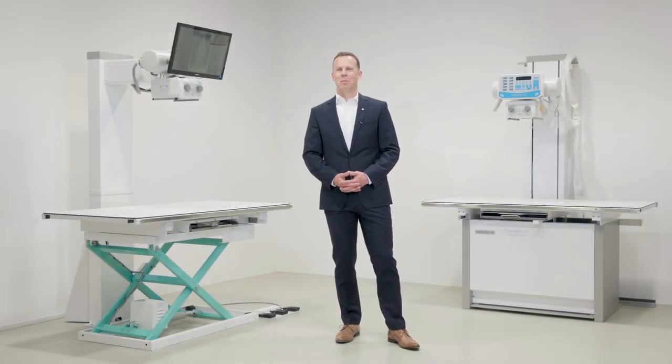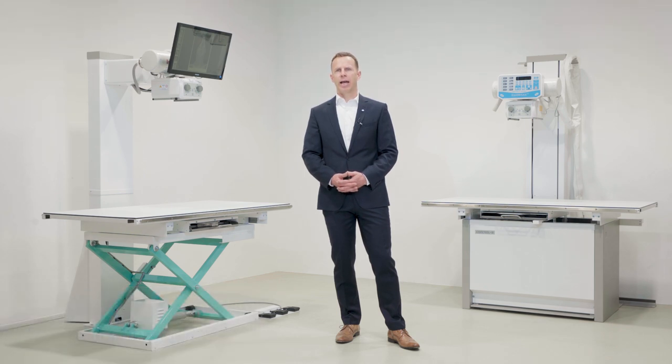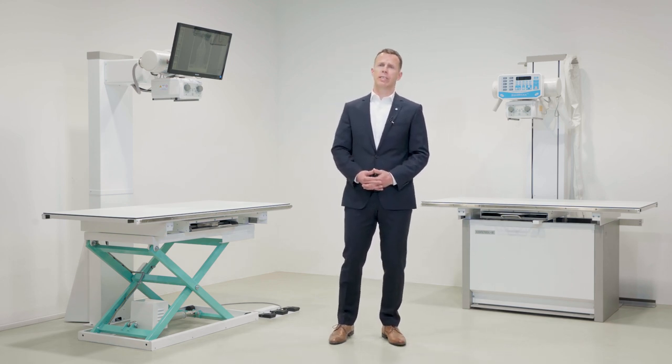Welcome to ControlX Medical, maker of high quality radiographic systems. Today I would like to introduce to you our ZoomX line of veterinary x-ray solutions for small animal practices. In doing so, I will also highlight a few important product enhancements we've recently made.